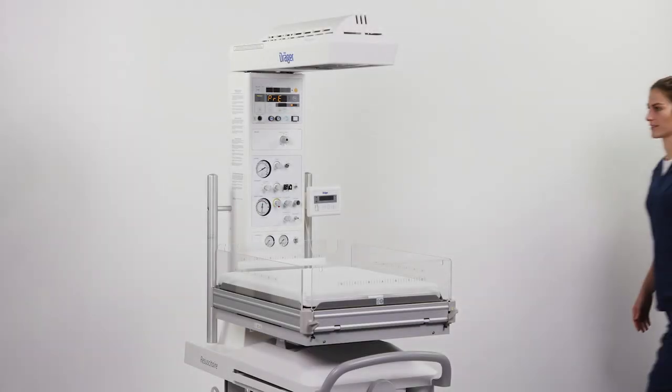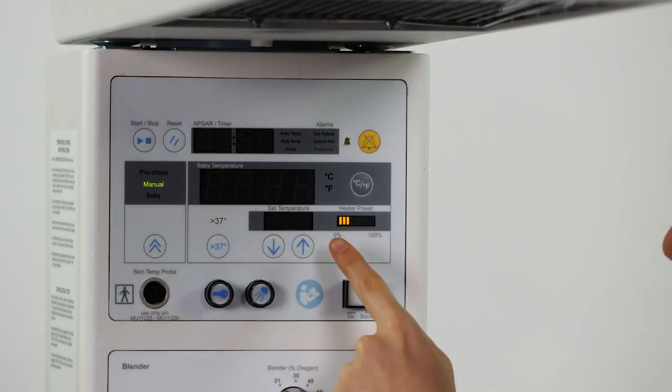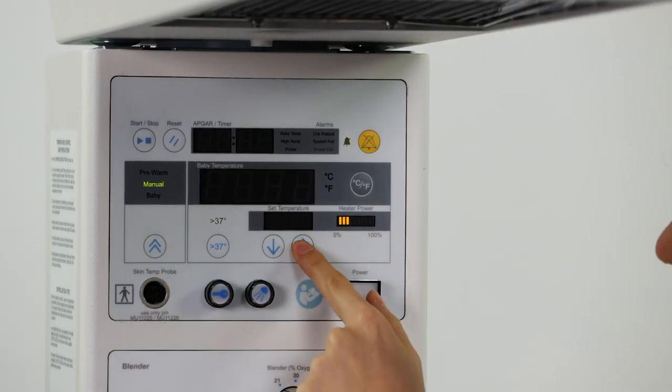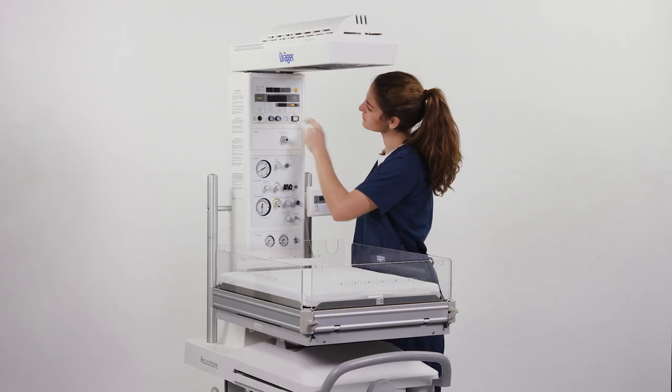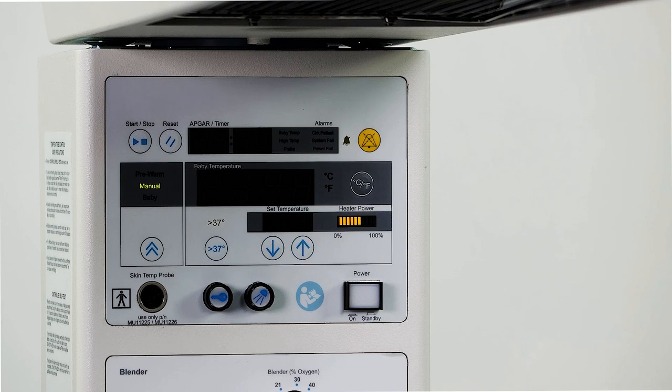Right before placing the newborn onto the Resuscitaire soft bed mattress, place the device into manual mode. While in manual mode, adjust the heater power output to as low as 10% and up to 100%. Adjust the heater power from 10% to 100% using the up and down arrows directly underneath the set temperature LED display.